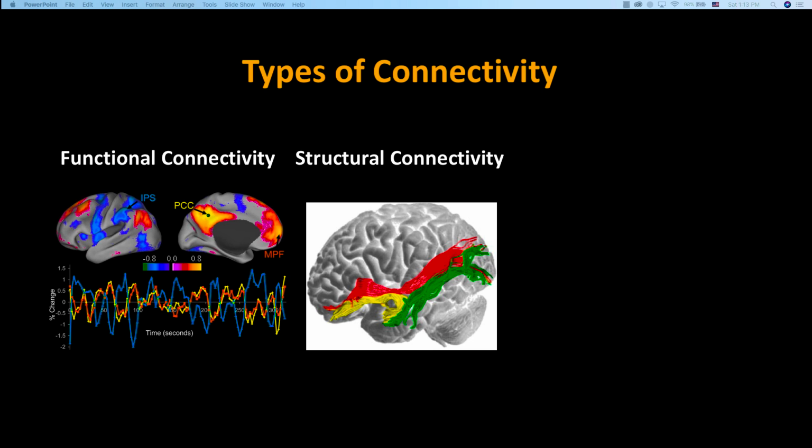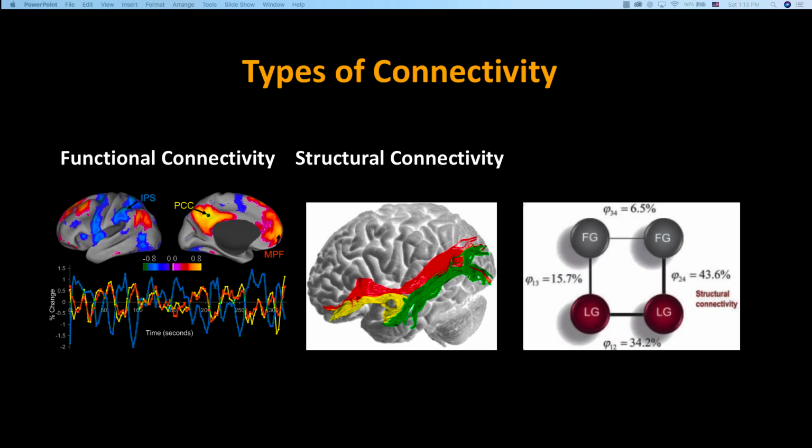But I am working on a tutorial with MRTrix, if anybody's heard of that. It's a diffusion analysis software package. But at the end of this workshop, we will be creating these things called connectomes, which are these correlation matrices for all these different regions of the brain, how they are correlated with each other. You can also do that for diffusion analysis as well, to see how many of these streamlines connect different parcellations, and then you can use them to see if there are certain matches between the two or if they differ between groups. So a little teaser, but that's to be continued, and also to make the distinction between those two things pretty clear.